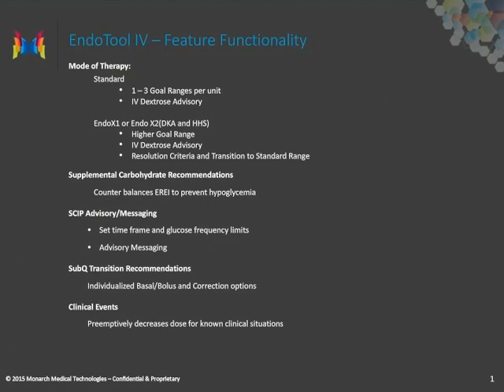Clinical events can be utilized to preemptively decrease either the dose or the model when a clinical event that is known to impact insulin needs has occurred.